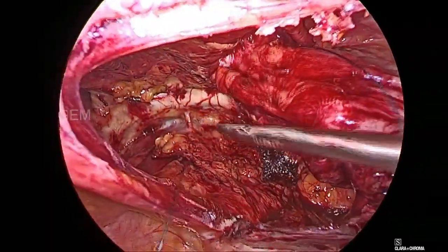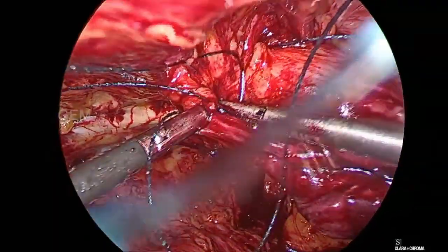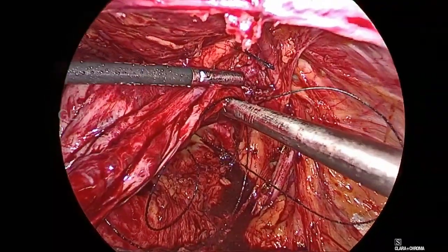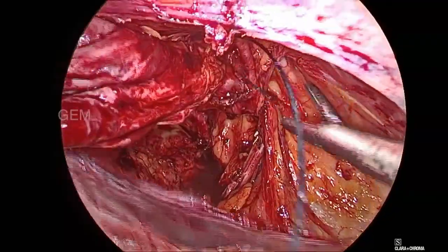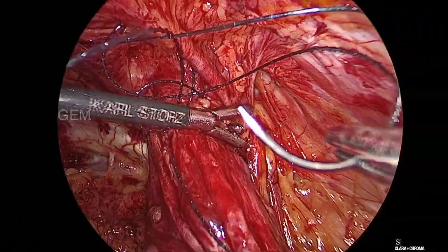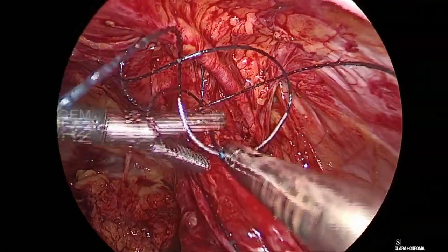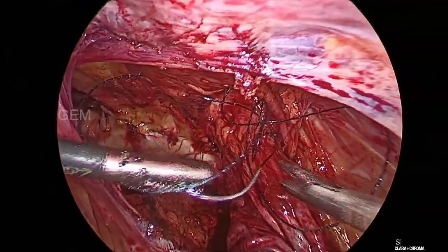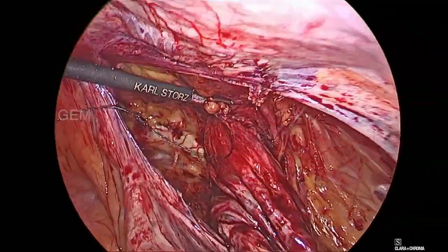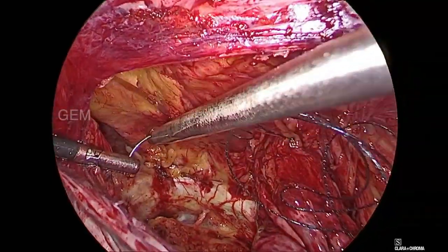We will circumferentially plicate the hernia. At the neck we have taken complete plication. This is a V-lock suture which will hold by itself without cutting. We continue the thread to go on to the opposite side.